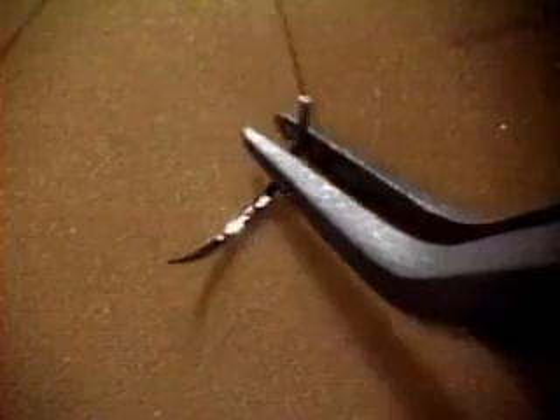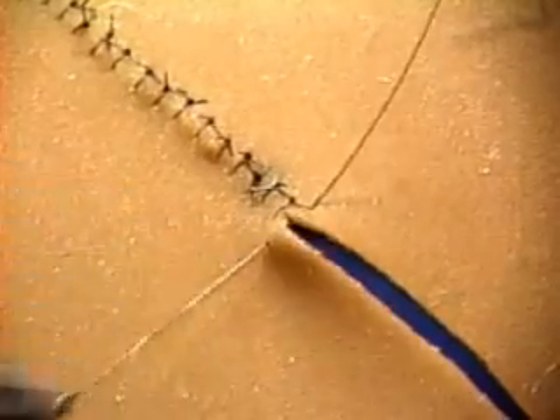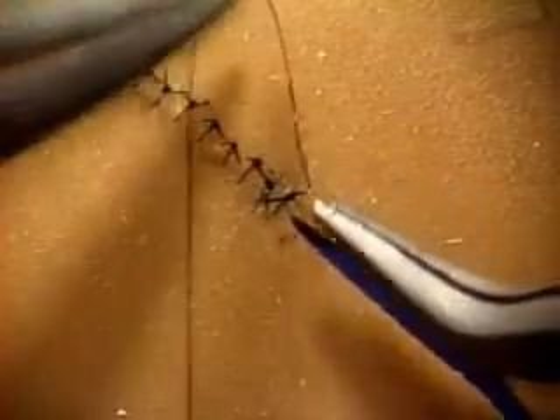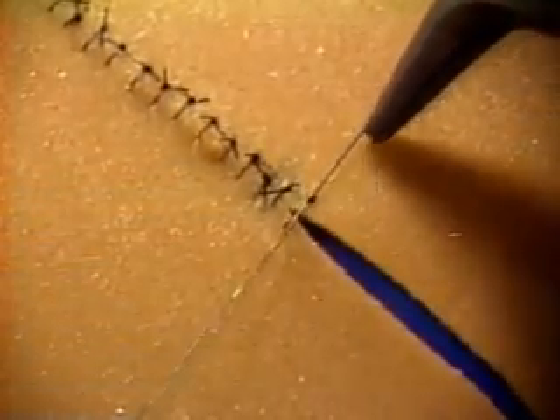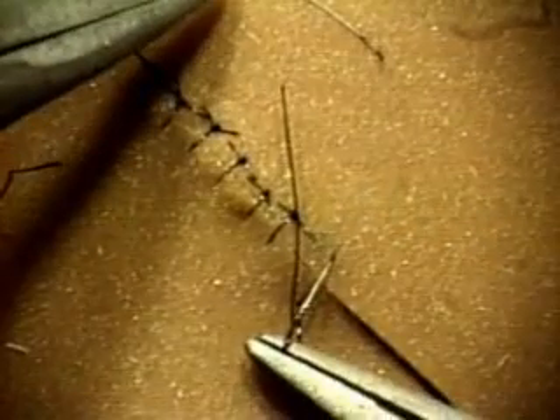In this tape I'll show you every step and every pitfall in the deceptively simple process of basic micro suture technique. We'll look in detail at picking up the needle, passing it through the tissue, pulling the thread through, and last but not least, tying the knot. As we go along we'll take a close look at all the common causes of frustration, entanglement, and despair, and see how these can be avoided. Throughout this tape the instructions are for a right-handed person; if you're left-handed you might prefer to watch it using a mirror.